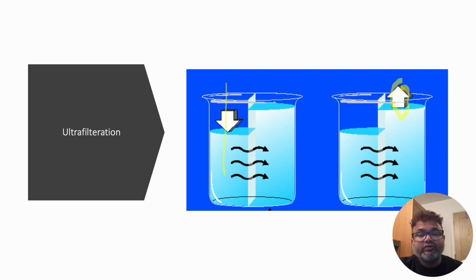One of the modes which we use in continuous CRRT is called SCUF, which only uses the ultrafiltration mechanism. So if somebody asks which mode uses ultrafiltration as a mechanism in isolation, that is called SCUF, slow continuous ultrafiltration. Going to the next slide.